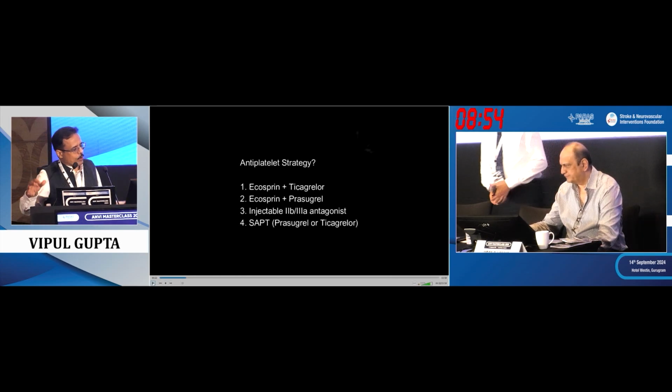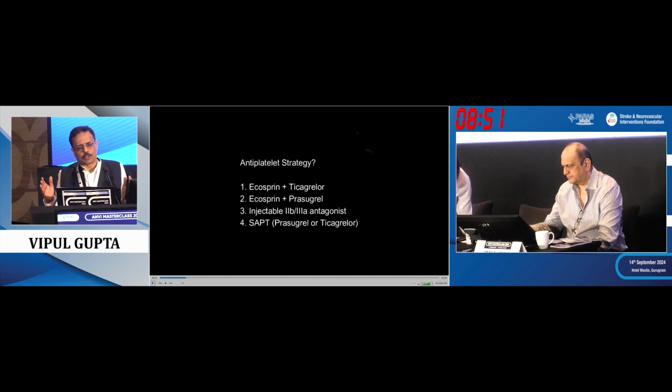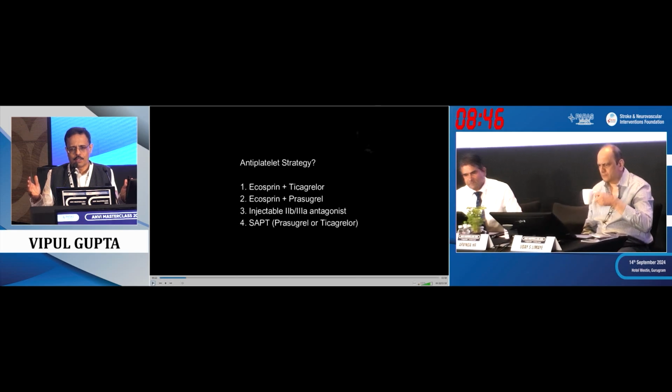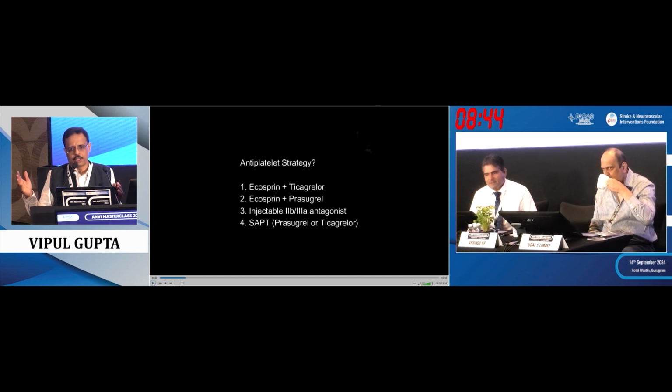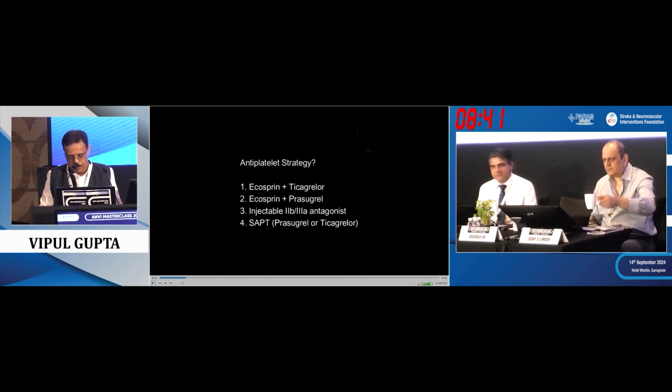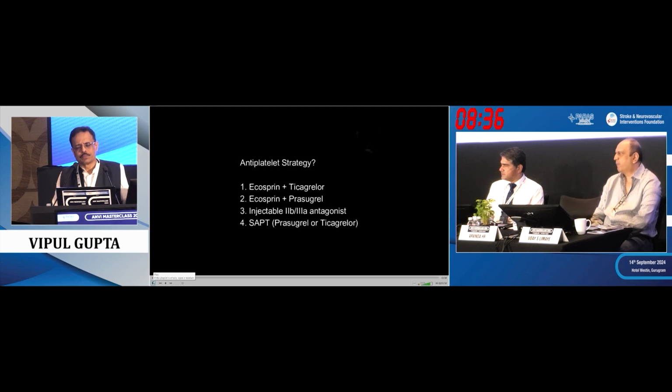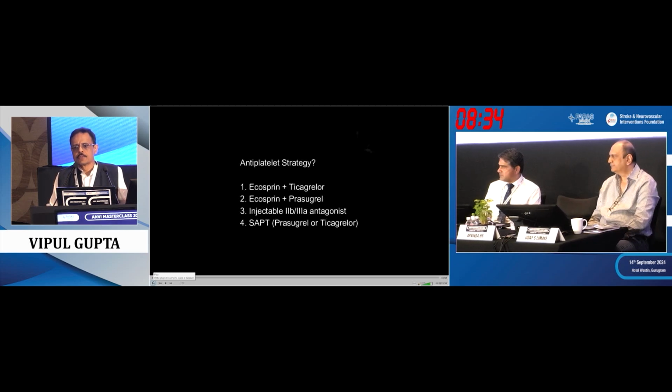Okay, so what we do is we load them just before, and then we go ahead with it. And Dr. Vikram, in your department, do you do preloading or do you use injectables for blister aneurysms? How do you handle them? For blister, I usually give prasugrel 2 hours before the procedure, and usually 30 milligrams is enough. I don't give 60. Then on the table, I will give IV aspirin just before the stent is deployed. That has been my protocol for years now.